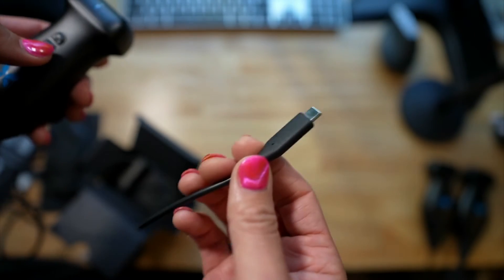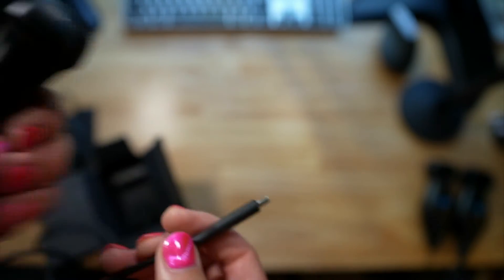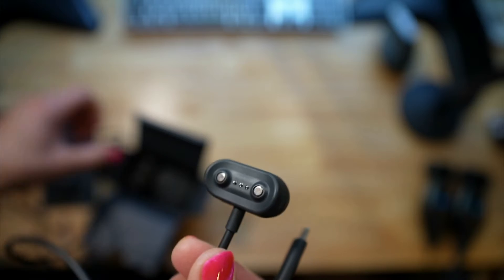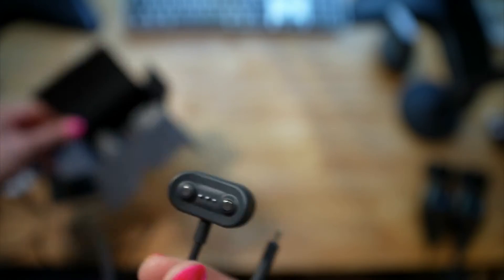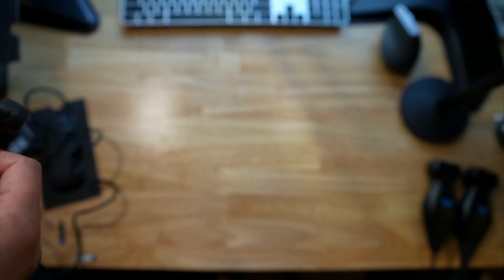This just plugs in and you're charging. Let me show you the difference between this charger — I didn't know I was going to be this excited about the charger. I mean, I haven't even tried the probe yet, but I'm already excited. Let me show you what the old charger looks like.